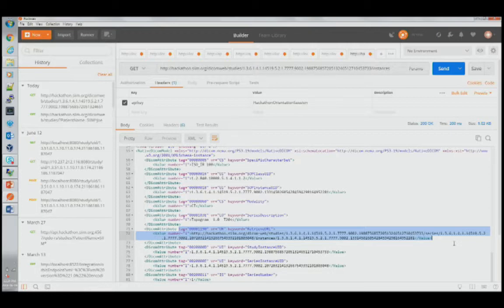Some of them make sense side by side, whereas some of them are stacked, meaning you go through them pretty much like a movie. You play them in sequence. Right? And sometimes you have a combination of both. Sometimes you'll put a couple of them side by side and you put the rest stacked. It can get really complicated.